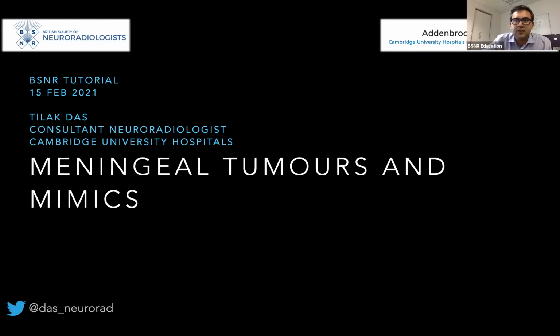A couple of things about DWI. Do you ever use DWI to decide between typical or atypical meningiomas? And someone has asked, is it particularly useful for hemangiopericytomas? My flippant answer would be, I only use it if those are the pathologist's initials, i.e. you wait for the pathology ultimately in most cases, because it is so difficult.